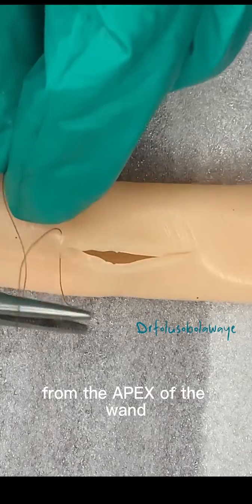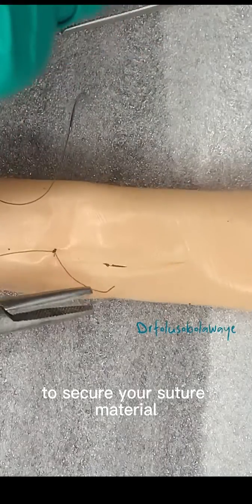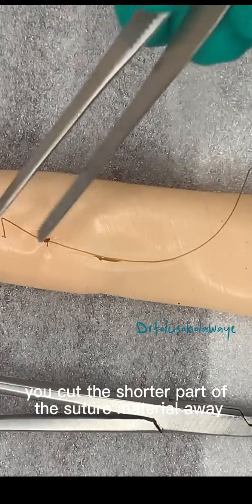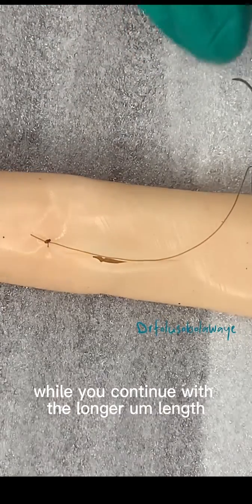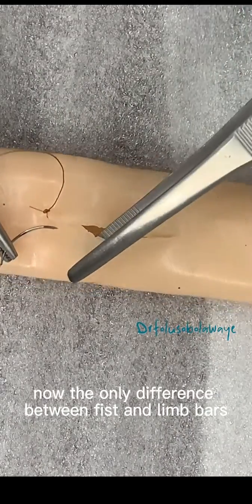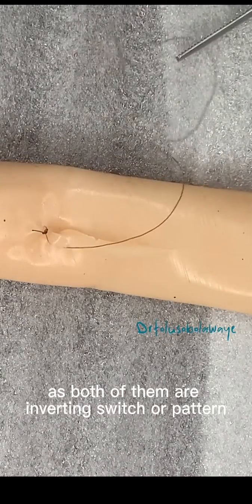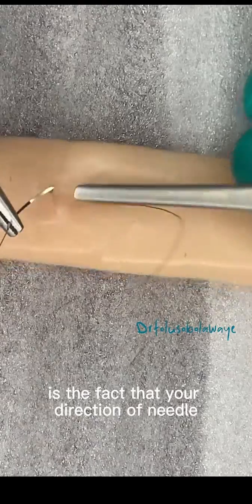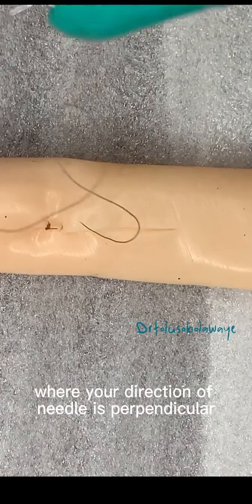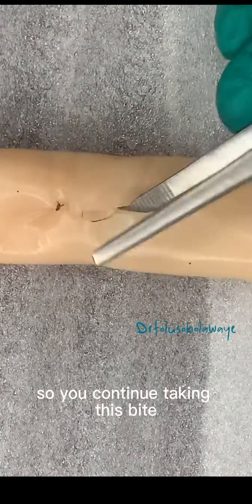Once this is done, you take two to three square knots to secure your suture material, and once you are done with this, you cut the shorter part of the suture material away while you continue with the longer length. Now, the only difference between this and the Lembert suture pattern — as both of them are inverting suture patterns — is the fact that your direction of needle is parallel to the incision line, unlike Lembert where your direction is perpendicular to the incision line. So you continue taking this bite till you get to the end of the incision line.